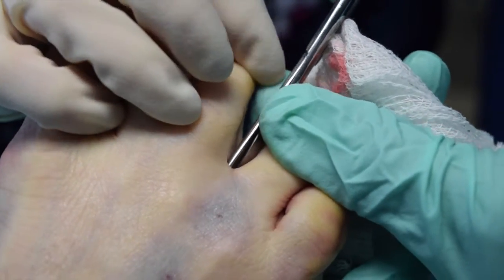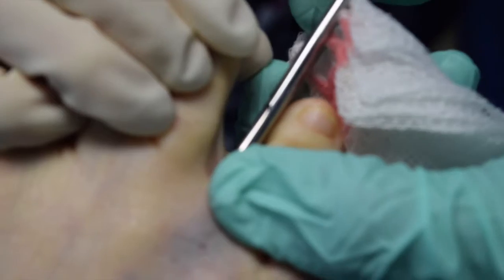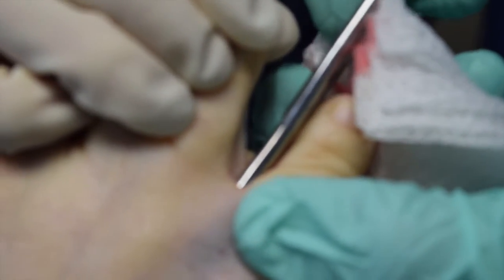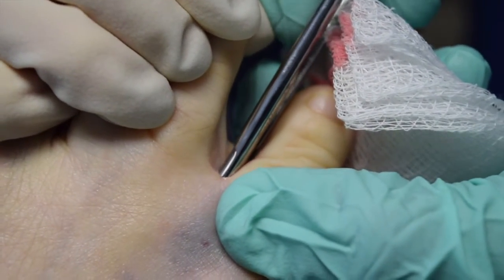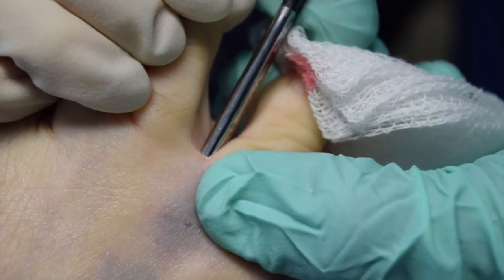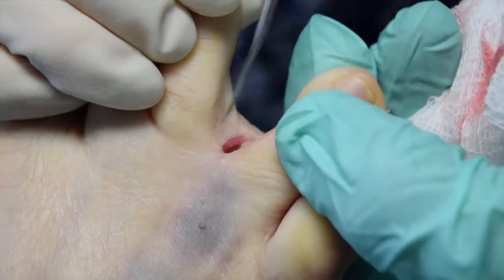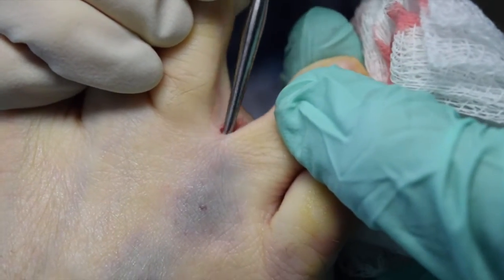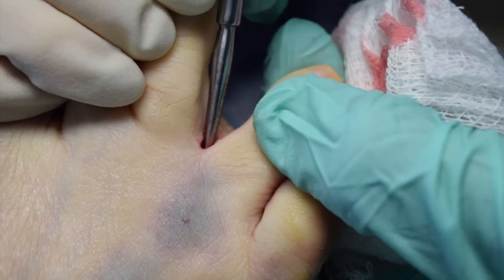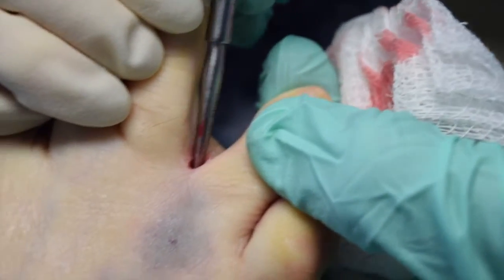So we've made a channel for both the dorsal part and we take this and grab the ligament and actually transect it. It's a very quick surgery — it transects very easily. Then we take our elevator to make sure we're all the way through and can palpate that deep and make sure nothing's grabbing our elevator. So that's the extent of the surgery.